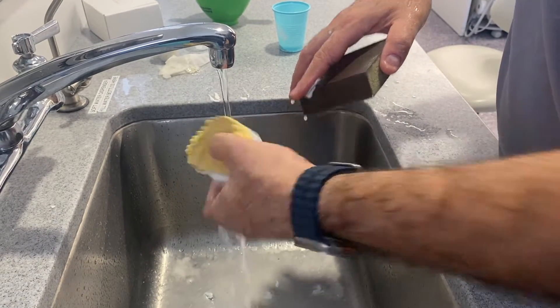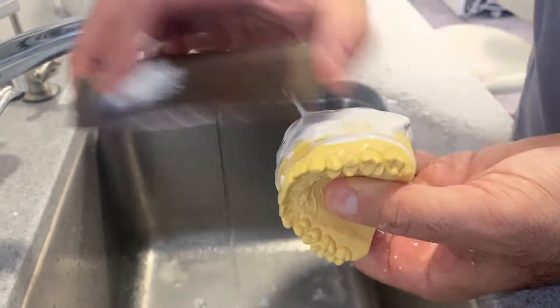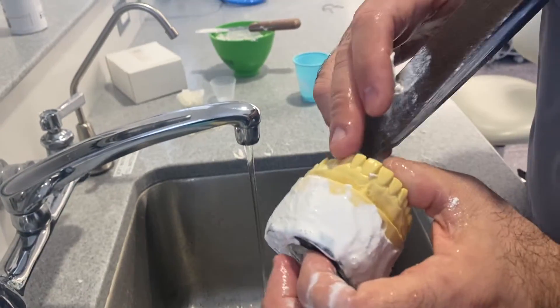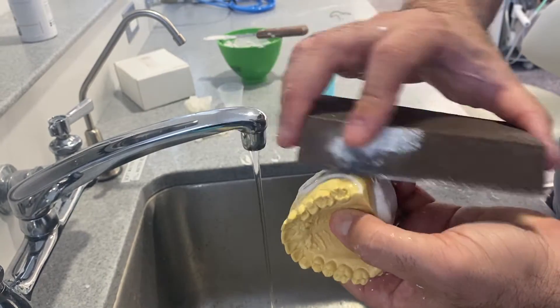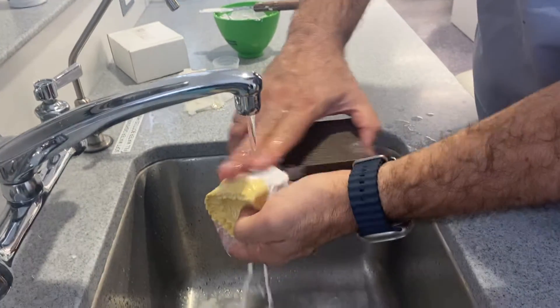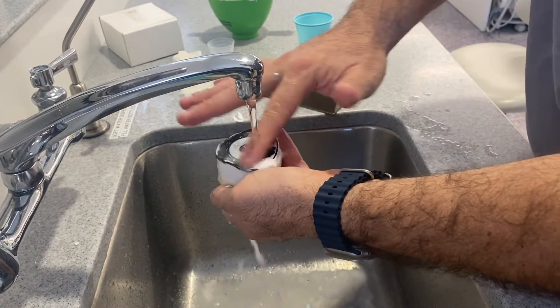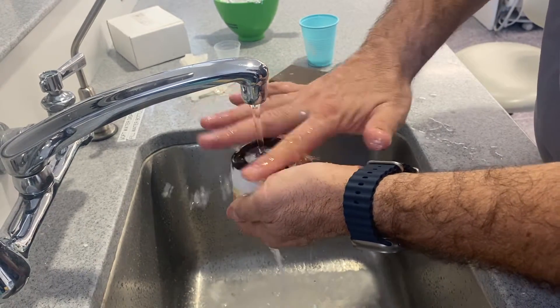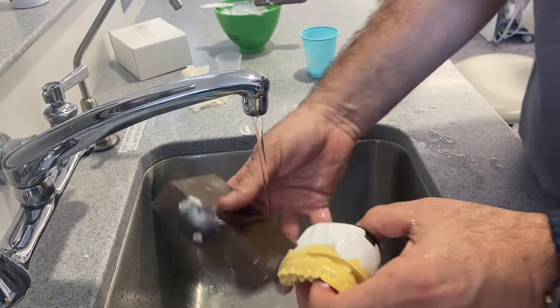For your practical, sink it in water and sand it out. Always sand towards the base plate — never sand in a way that rubs the teeth, or you'll start sanding the teeth. Always sand towards the base plate. Make sure your base plate is fully clean and clear of any plaster whatsoever. That's part of your grading, guys — we're grading finish and neatness.